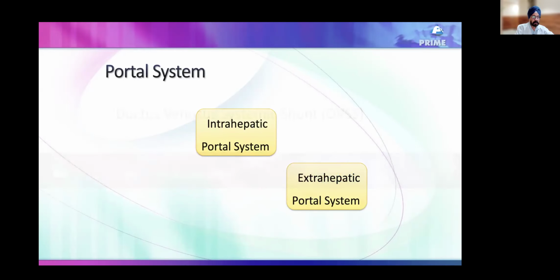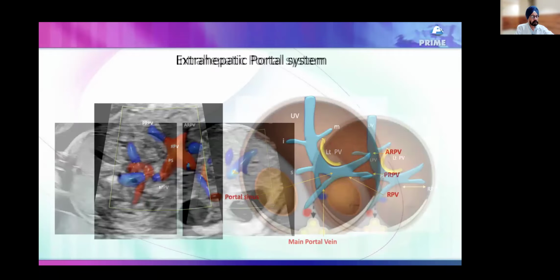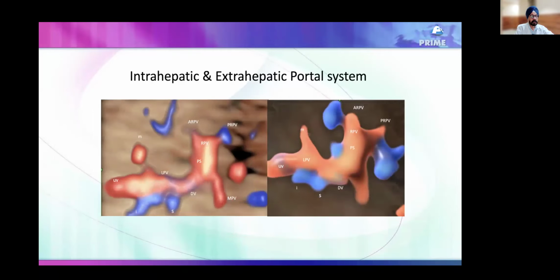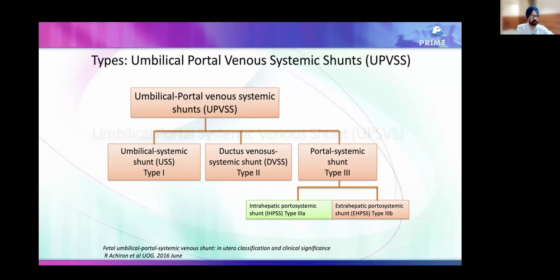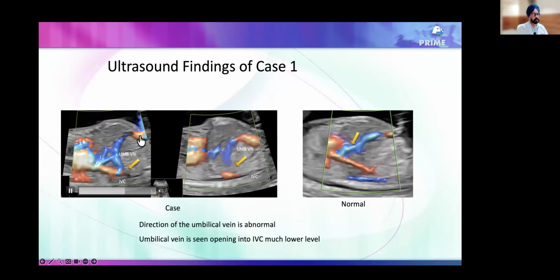So the ductus, I'll show you a few, because this is more of a fetal medicine or radiology talk. So I'm not going to show you all of that, I'll show you only the shunts which are important for the heart. Rest I'm not going to show you. Oh, I thought I had hidden those, but they're still existing. Okay, this is the one I wanted to show you.